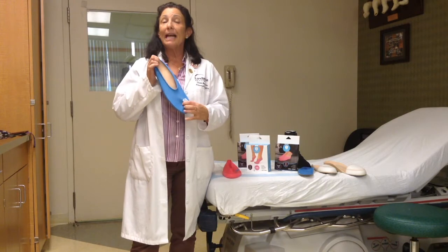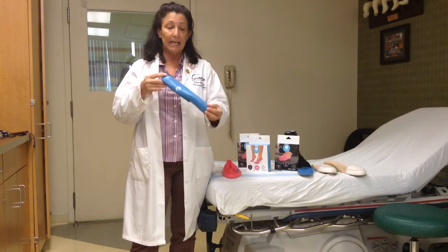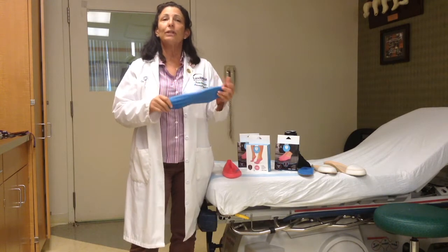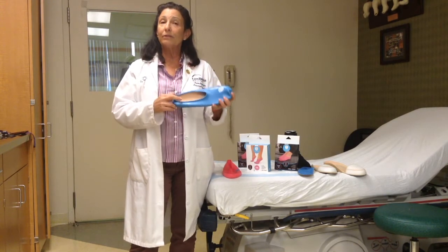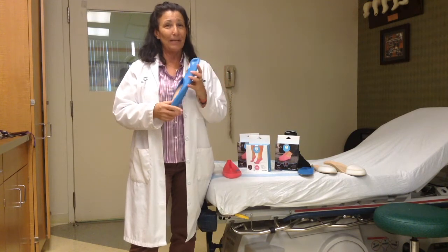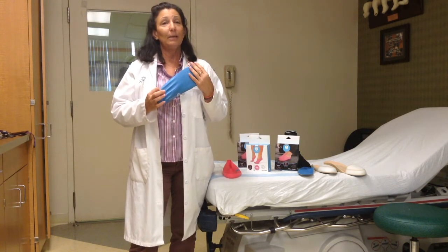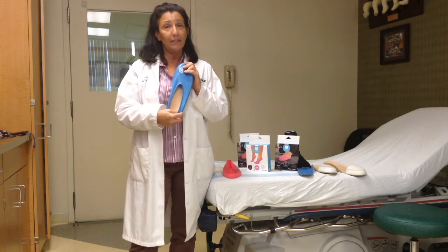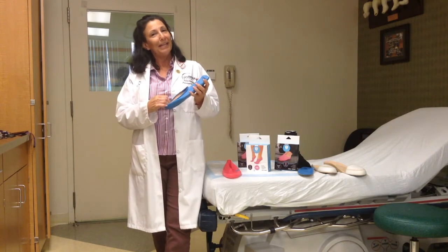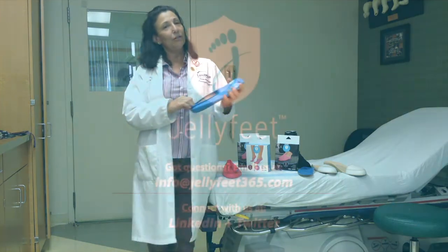The orthotic is housed securely inside the Jellyfeet. Also, it has a non-skid surface so patients can walk around their home comfortably and not be a fall risk. I appreciate that Jellyfeet paid attention to the detail and provided that in their foot covering for these patients who are highly compromised. Thank you again Jellyfeet for helping me to help my patients.